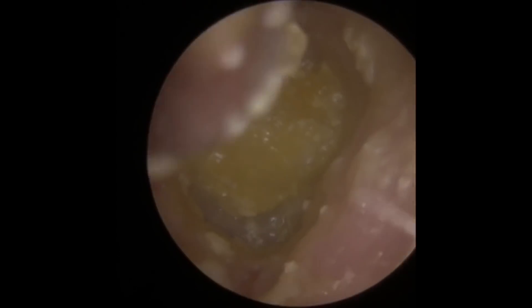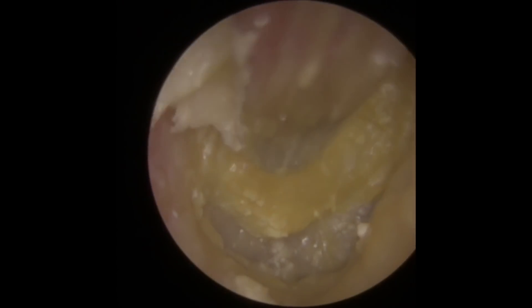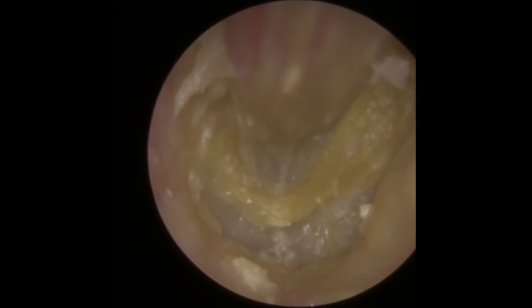So this is the second ear. I'm just peeling away, as we did on the other side, the outer section. Very similar type of material on this side — very hardened wax sitting on top of the skin in the canal, causing the skin to die off underneath it. We're going to lift with the crocodile forceps and just gently, slowly but steadily, pull this out. There we go — it's coming away nicely. You can see just how big this plug was. When we get behind it, we can see some dead skin at the roof of the canal and a large piece of this dried skin material here.